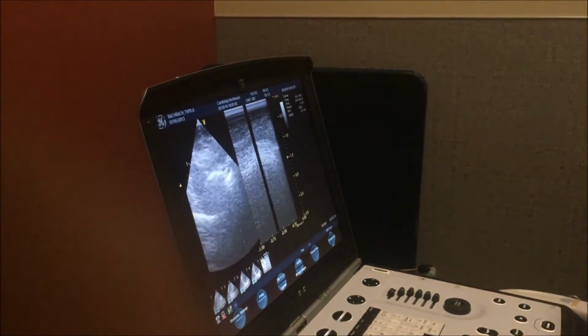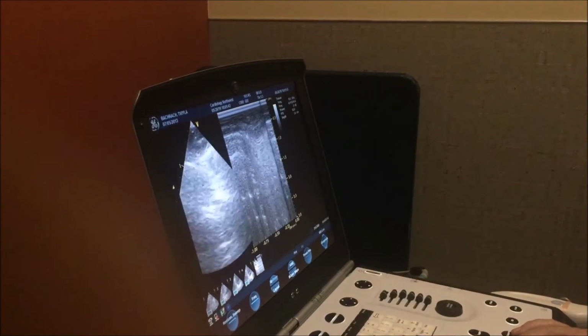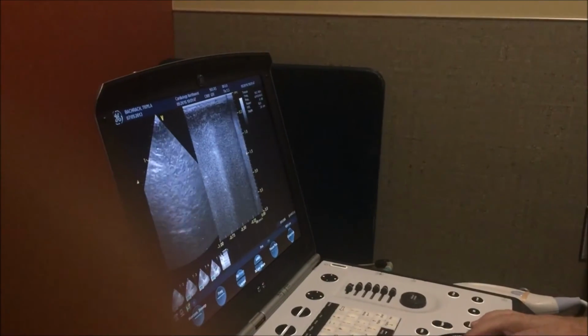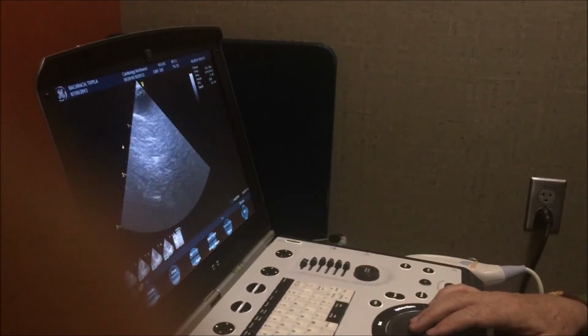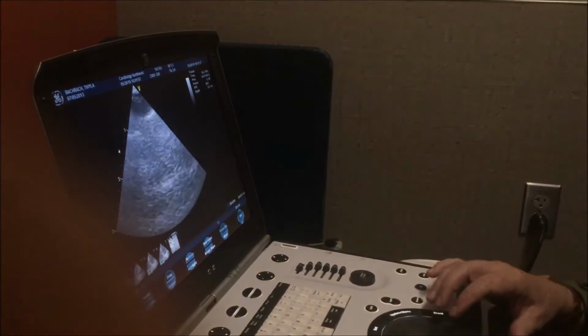So to me, that right off would suggest that we might not have primary heart failure here, because if we did, the left atrium gets very big, especially if we have heart failure that causes respiratory symptoms. It's usually the left side of the heart that is causing that.